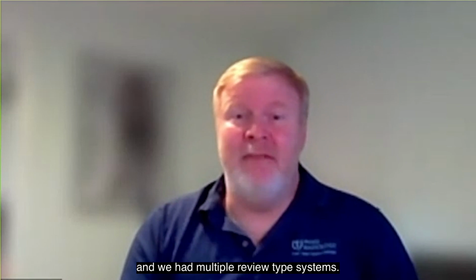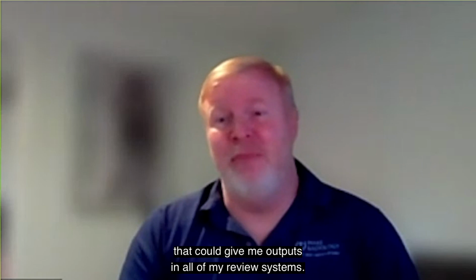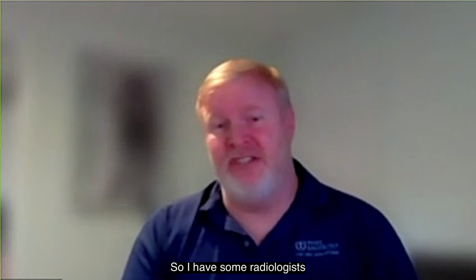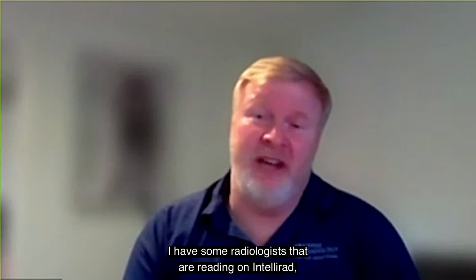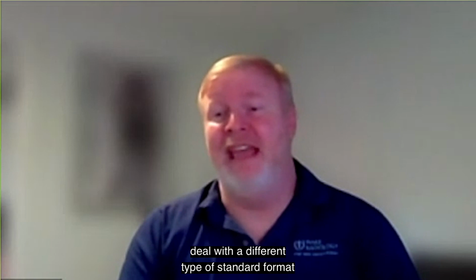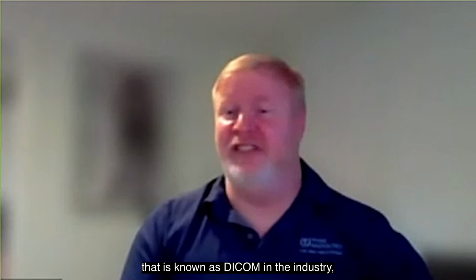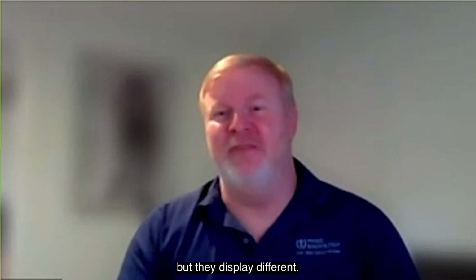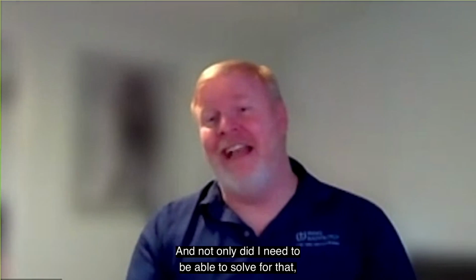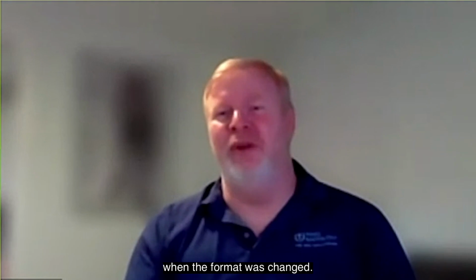And we had multiple review type systems. And so I had to be able to have a system that could give me outputs in all of my review systems. So I have some radiologists that are reading on a Hologic SecureView. I have some radiologists that are reading on IntelliRad. And those two systems deal with a different type of standard format that is known as DICOM in the industry, but they display differently. And I had to be able to solve for that too. And not only did I need to be able to solve for that, I needed to make sure that the value was still there when the format was changed.